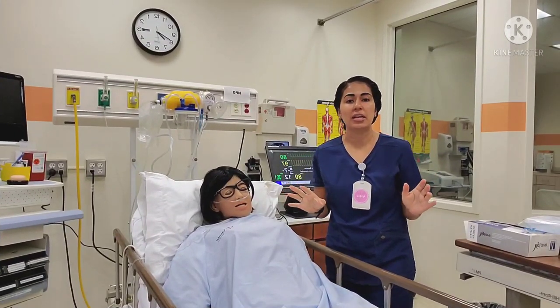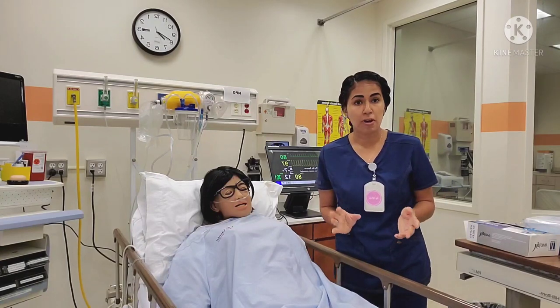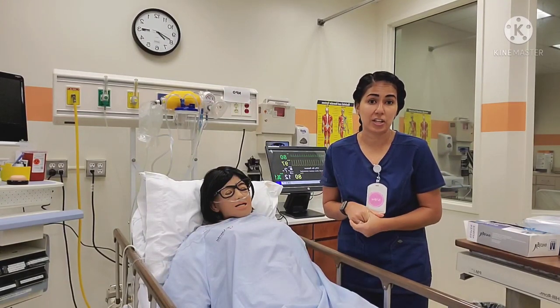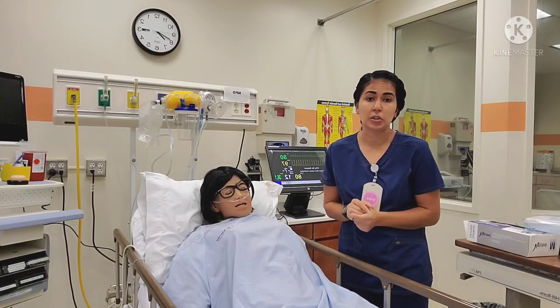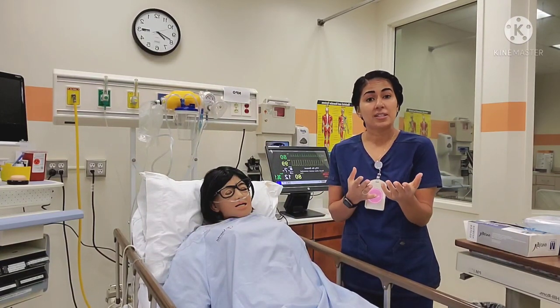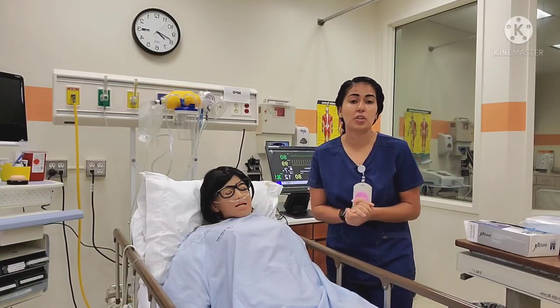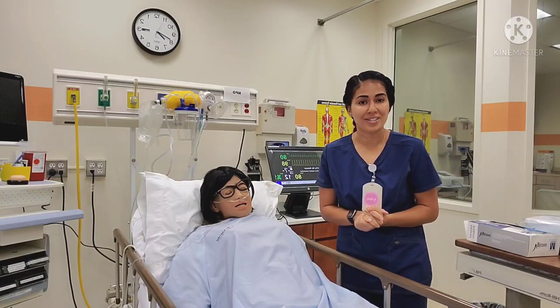As with any skill I teach on my videos, I do use a reference for this tutorial. I am using the Taylor's 5th edition Clinical Nursing Skills textbook. For your validation or if you're going to perform this procedure in a hospital, make sure that you refer to the appropriate reference or policy.